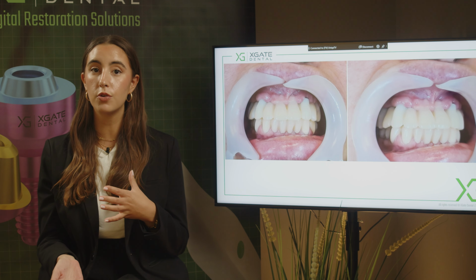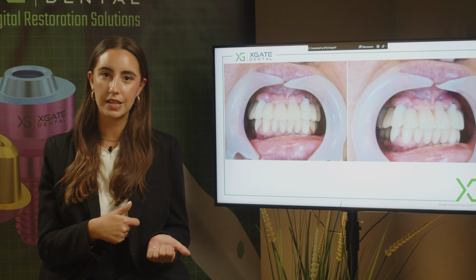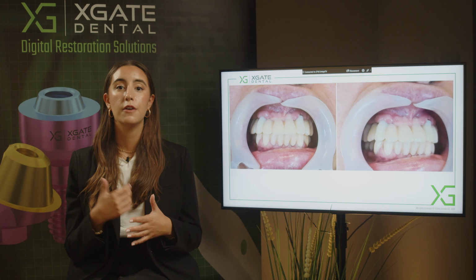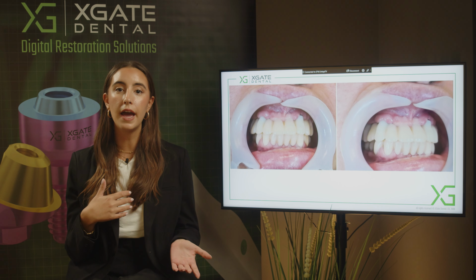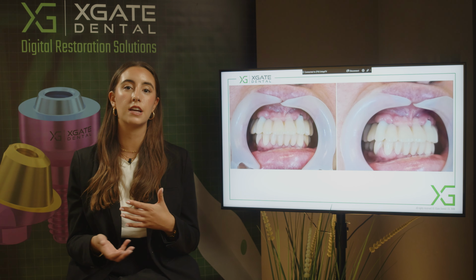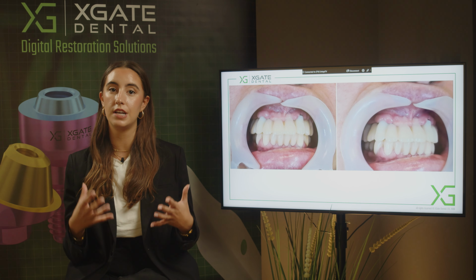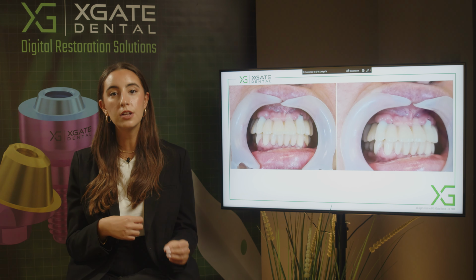You can mill it from zirconia, and you can already send it to the manufacturing and get the same design as with the provisional bridge. For example, a problem with the PFM is that you have a metal carcass and the technician is adding ceramics on top of the metal. So you won't get the same thing every time. The anatomy will change a little bit each time.